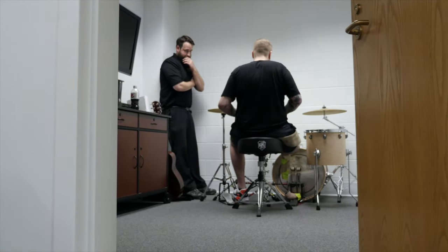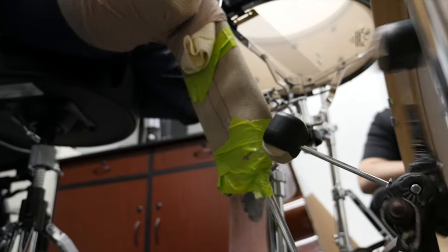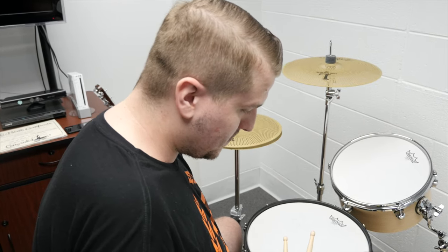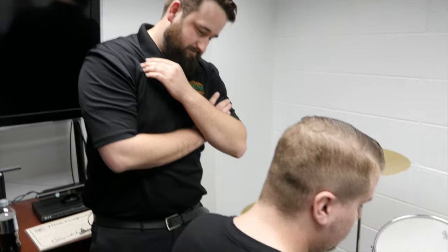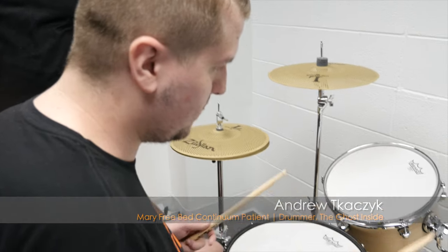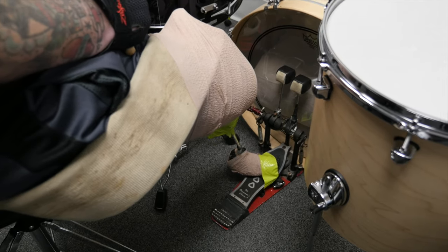I was shocked when Steve MacGyver'd that right leg with him and how good he played. This is possible. The MacGyver leg is put together with a putter — a golf putter — duct tape, a little fire hose to give it some stability, and some Coban wrap. And he was able to play the drums almost like he normally would. All those little fills, he was even surprising himself pulling those triplet things off. And this is just the beginning.